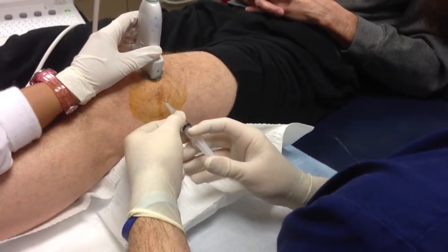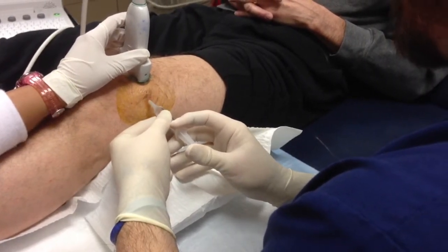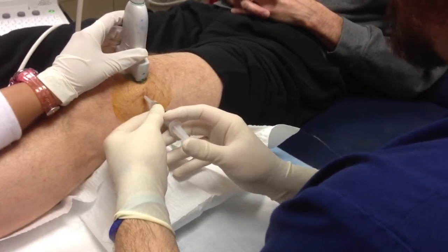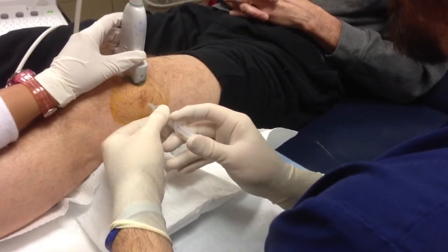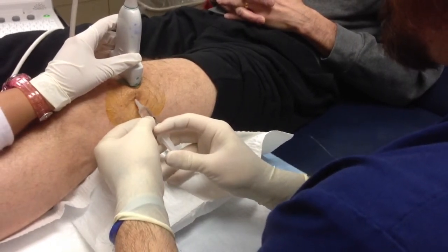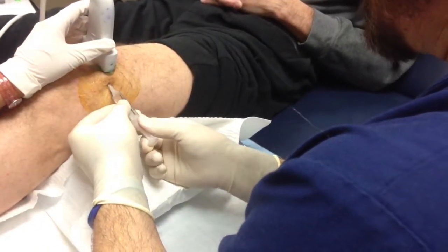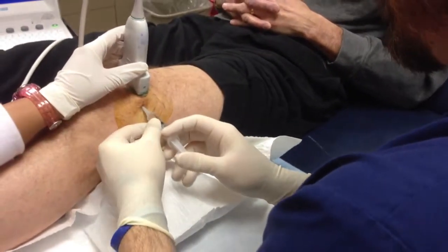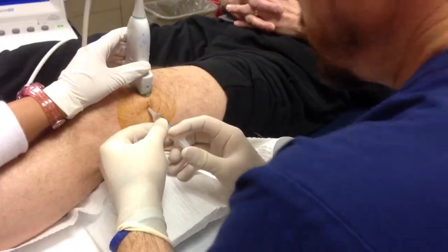Usually it's pretty much all soft tissue that I'm going through. This is a 27-gauge needle — sometimes you can see it, sometimes not. I'm a little bit superficial, so I'm going to pull back. You can see the needle there in the upper right. I'll pull back and go a tiny bit deeper and put a little bit more local anesthetic in. You can see I'm right in the space there. We're just adjusting the ultrasound a little bit to get a perfect view.